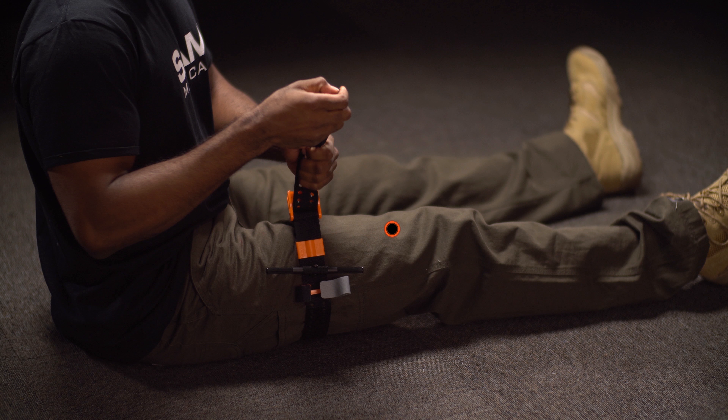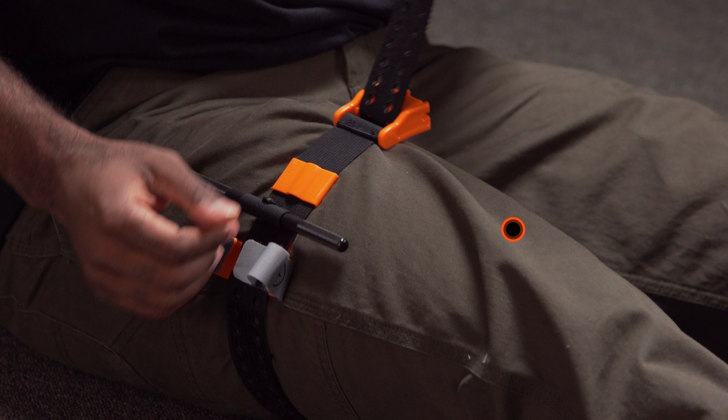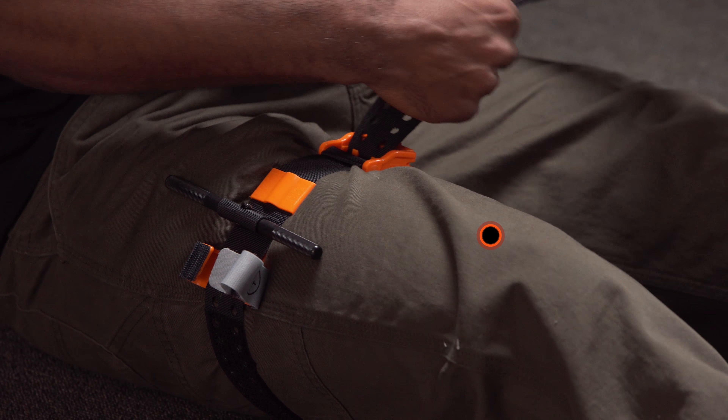Next, grip the precision strap close to the buckle. Pull hard and steady against the True Force buckle until the strap stops. Depending on the environment, you may hear an audible click indicating True Force is activated.